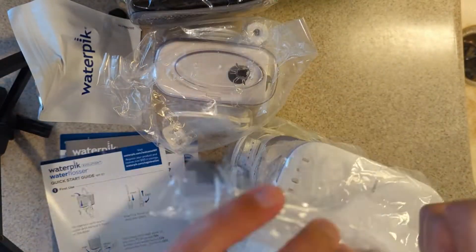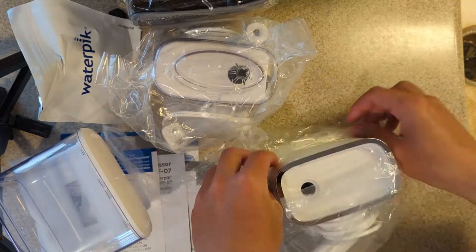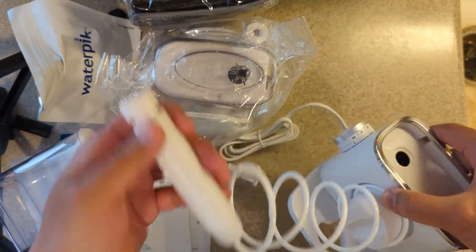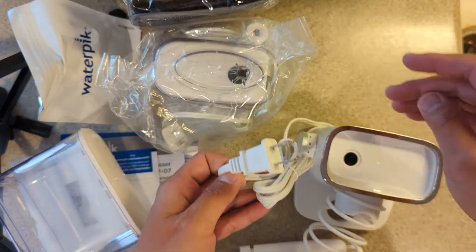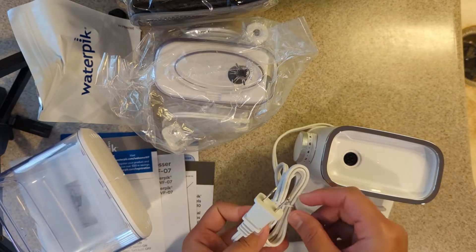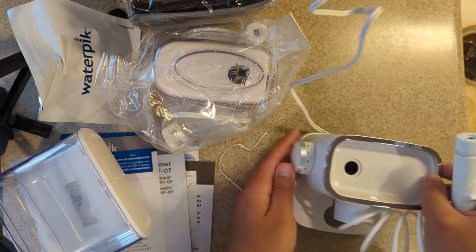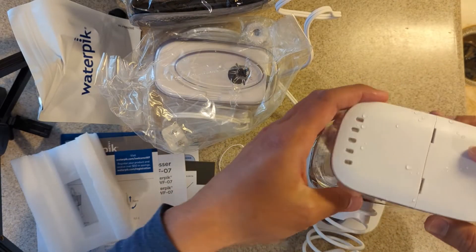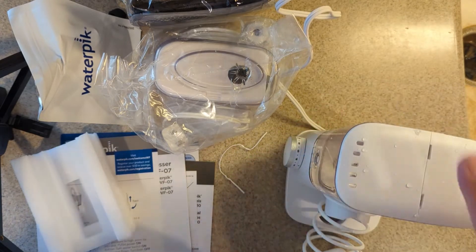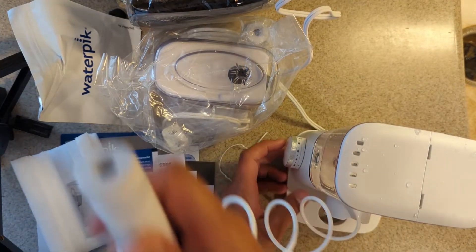Let's open it up — this is the water reservoir, just like this. Assume we can just plug this in and it's going to start working. Okay, we got some water in here, put it together, and now if we turn this on.